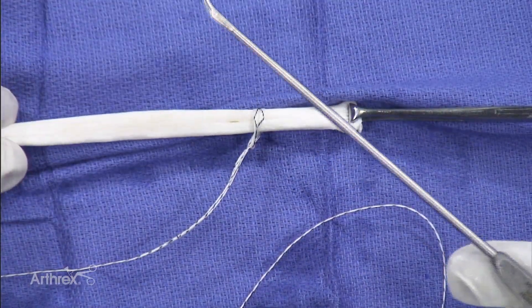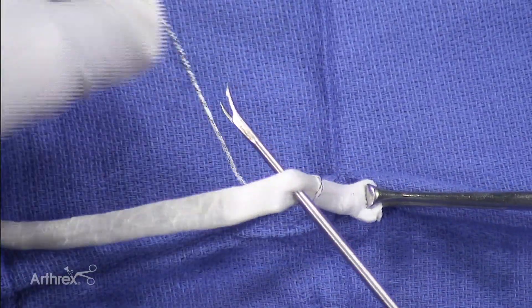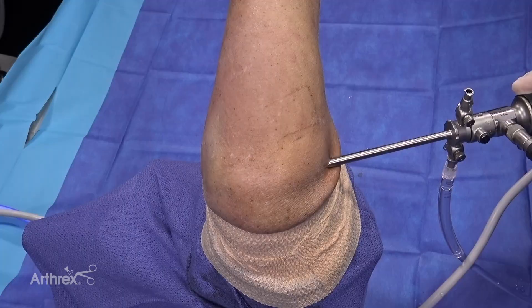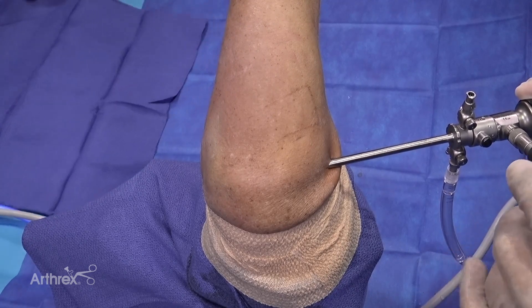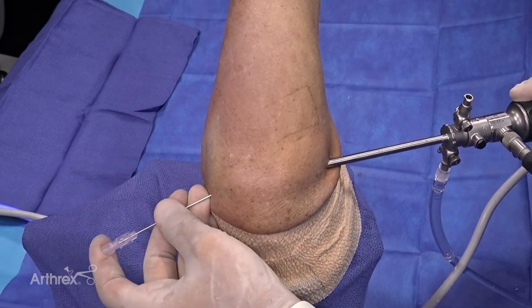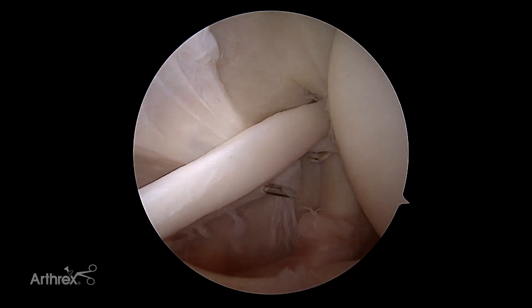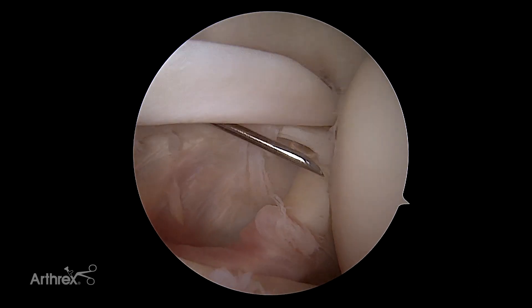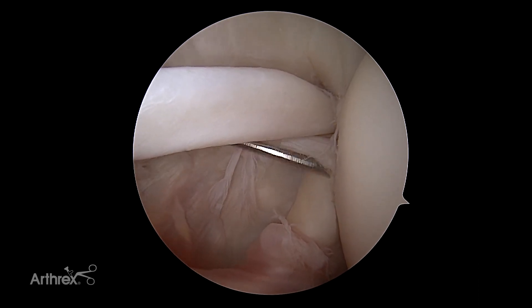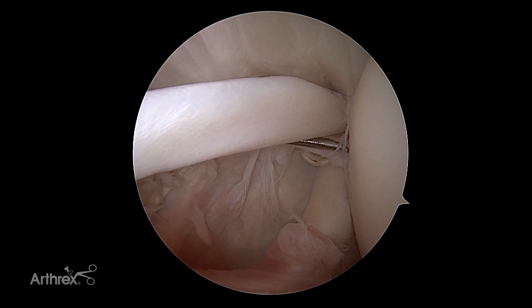Once this is tightened, we're going to use the penetrator to pierce through the tendon and then grasp the suture on the other side. One of the key aspects of this procedure is where you make your anterior portal, as it will make the procedure significantly simpler. It is key to place the portal in a position where you can easily access below and above the biceps to be able to easily pass sutures above and below. The other key is you have to be able to access the top portion of the intra-articular groove. We are going to be placing our anchor at the top portion right above the subscapularis tendon, at the most distally visualized portion of the intra-articular groove, and placing your portal medial enough will allow you to have access to that top portion of the intra-articular portion of the biceps.